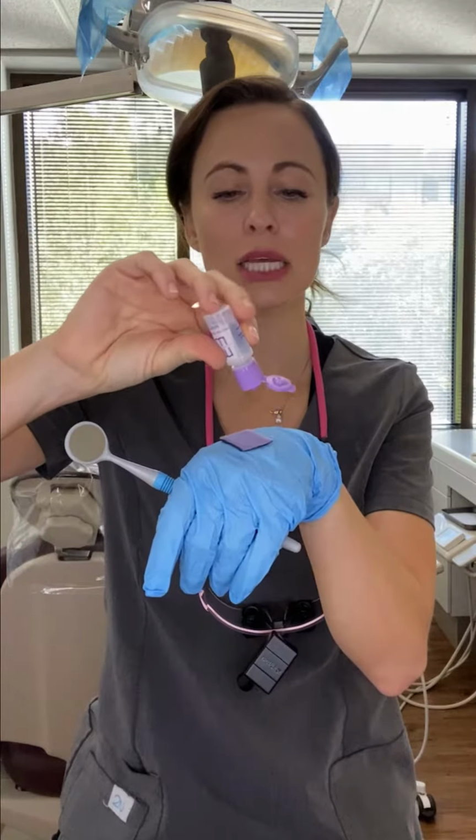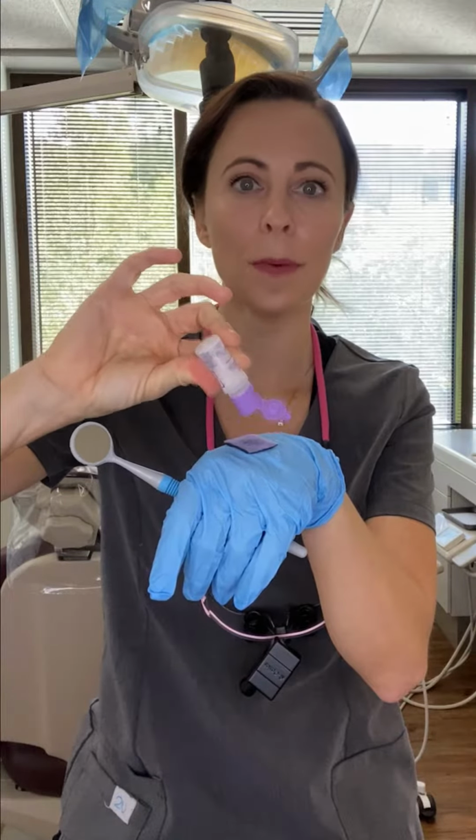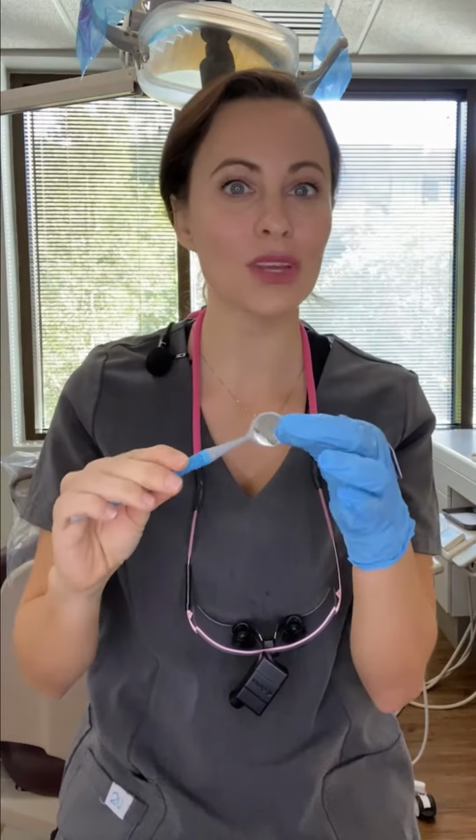So I put it on my glove, and then I put a few of these anti-drop or anti-fog solutions. I'm kidding. It only takes 1 or 2 drops. And then if my mirror is fogging or I need to clean it off, I just swipe it on my glove. I don't have to pick up gauze, which eliminates the problem of fuzz left on the mirror lens from like the cotton 2x2s, right?